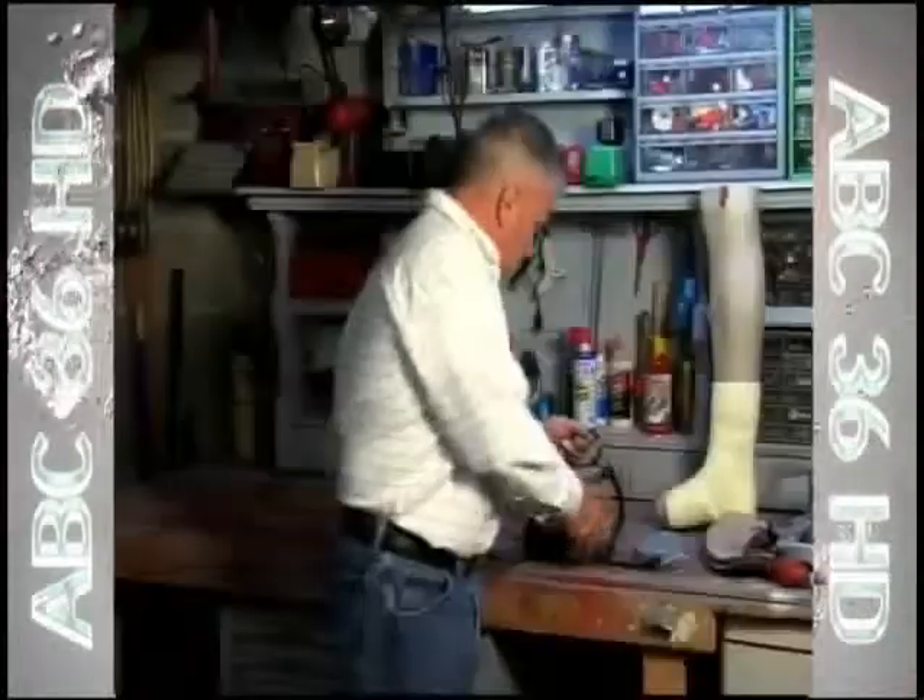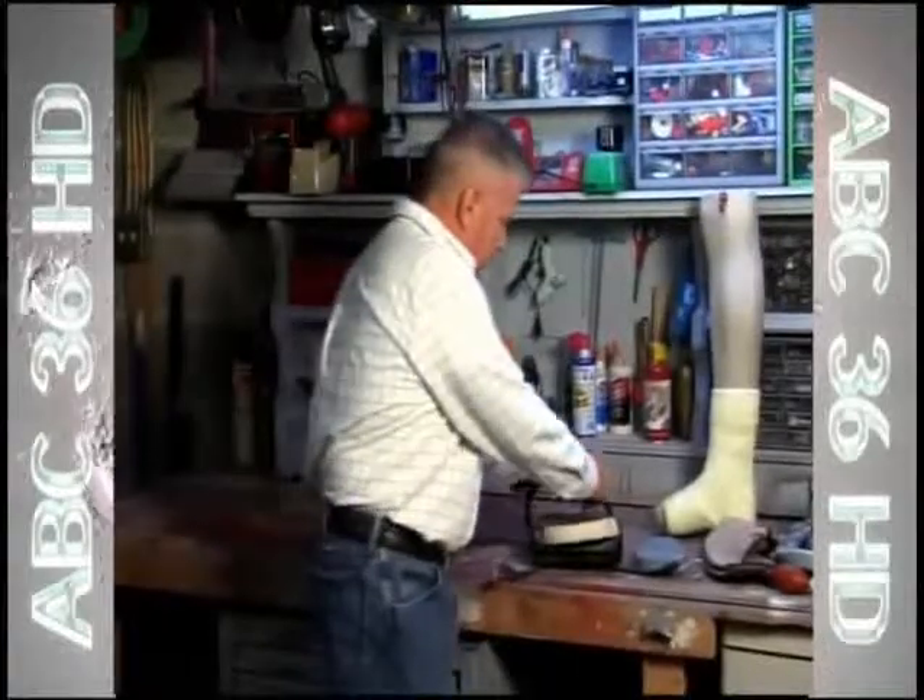Bob Benavania had never invented anything in his life until he had to wear a cast for a stress fracture in his ankle. He sent me home with crutches, which seemed fine at first until I got home and I realized that I was going to have no relationship with these crutches — they were going to have to go.